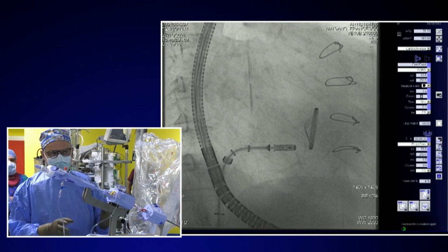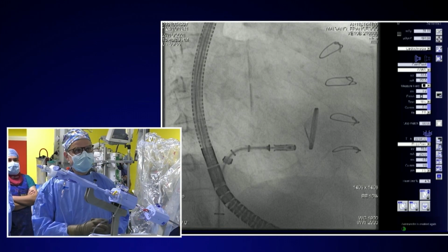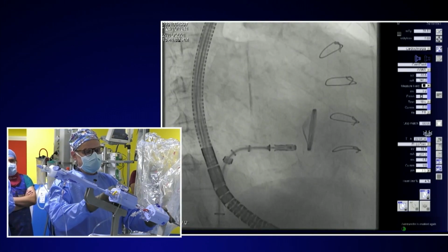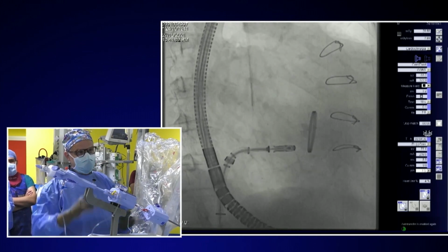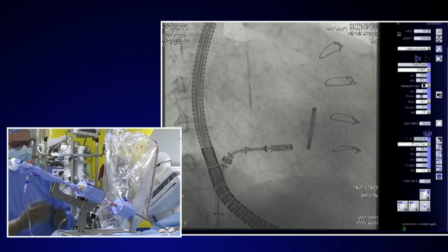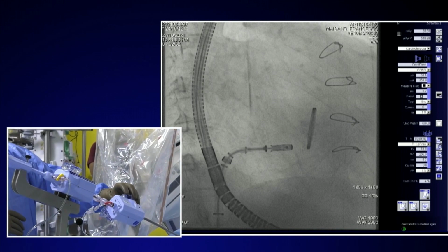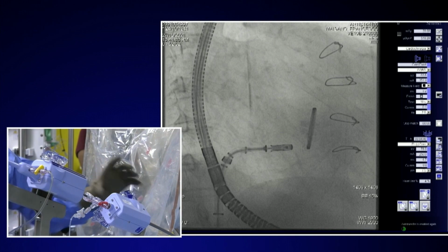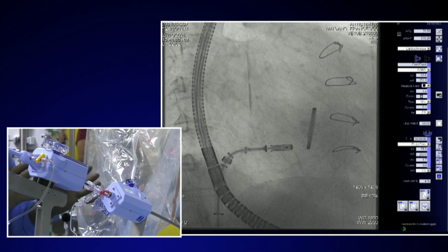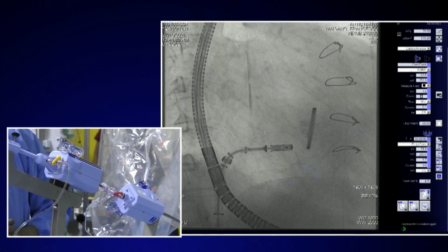We don't have too many problems with height, but actually it was a problem with an off-label MitraClip system. Also, the length of the CDS is shorter, so the CDS doesn't go too far forward, and the problem of falling into the tricuspid is less of an issue here. Finally, and not a secondary issue, is the septolateral knob, which adjusts for the discrepancy between the line of the inferior vena cava and the center of the tricuspid valve. So these are the features.